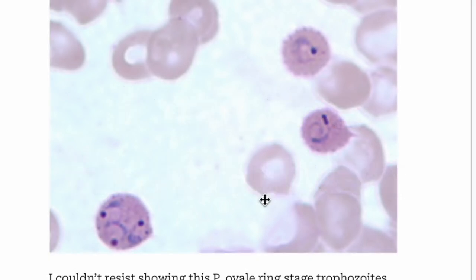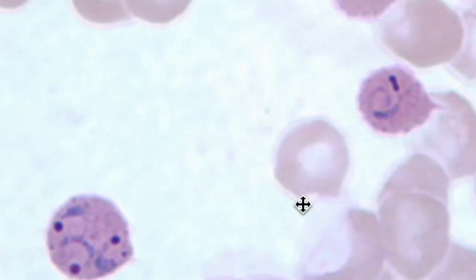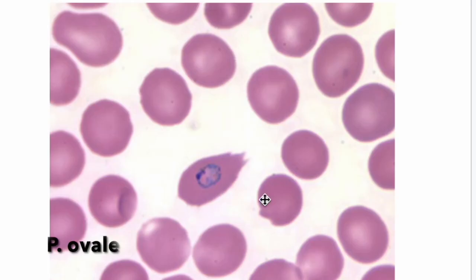So you've got the cell with this edgy, zigzaggy structure. So you'll get the fimbriation happening. And here's another fimbriation feature. It just looks like the edges have been ripped off a little bit, a splattered look.